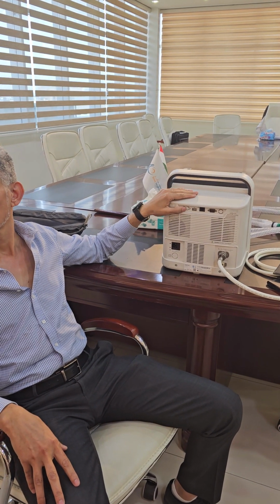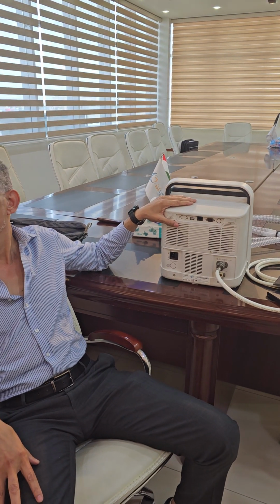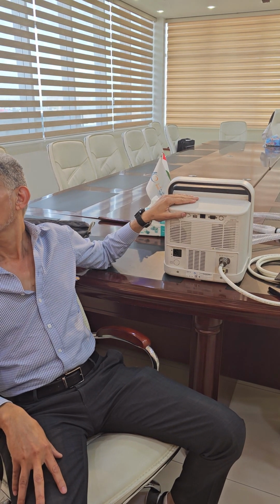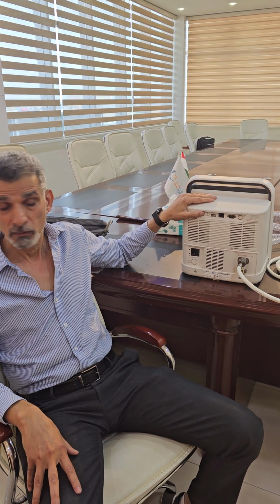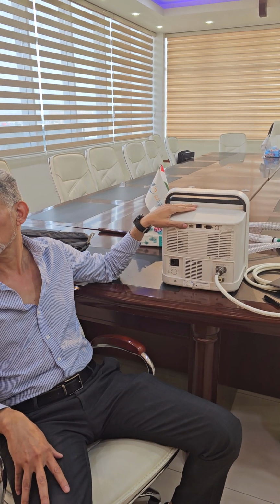So almost always we have to use a ventilator without a compressor. It's not acceptable at all to use a ventilator with a compressor inside intensive care. It should always be without a compressor. A compressor is used for transport. Or sometimes they use it temporarily, like doing anesthesia and surgery. It's acceptable. So you can see that there is no black tube for this because there is no air. It has a built-in compressor because this is a portable transport ventilator. So this is only oxygen.